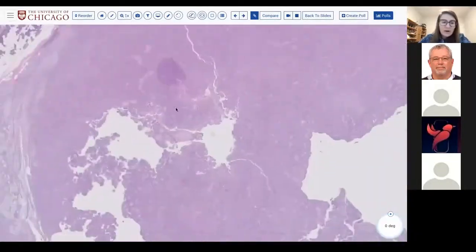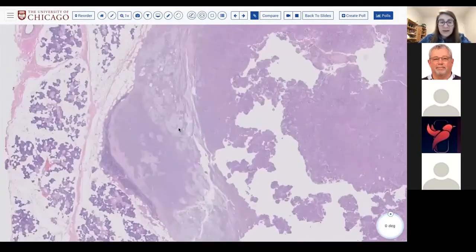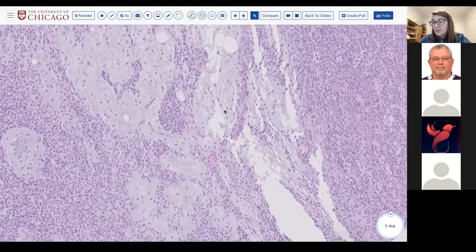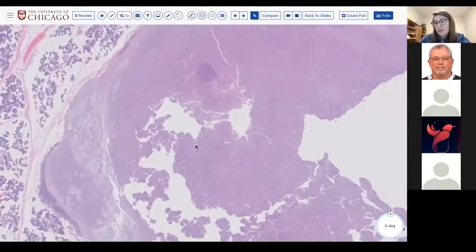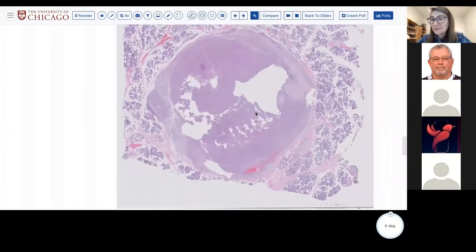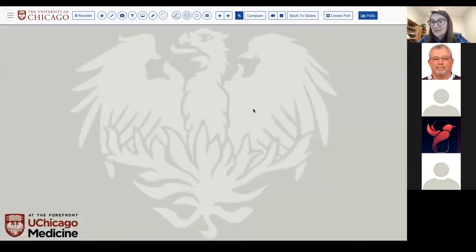I would probably argue that in light of the circumscription, the low histologic grade, and the focal myxoid, myxochondroid areas, I would favor this to be a pleomorphic adenoma as opposed to a circumscribed epithelial myoepithelial carcinoma. But if you have alternate thoughts, I'm very happy to hear them, because these can be challenging cases. All right, questions or comments? I see nothing in the chat. Myoepithelial predominant PA. Okay, great, excellent. We have at least one concurrent thought.